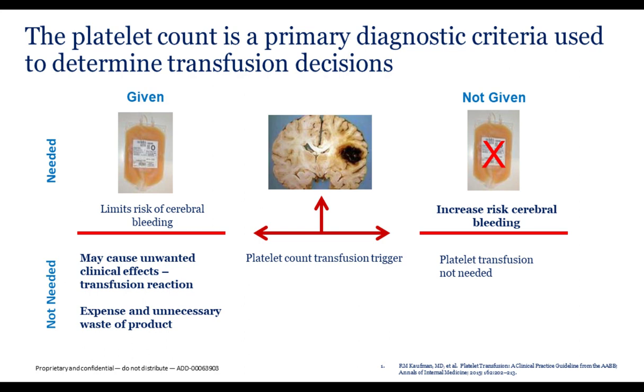Although sometimes the WBC fragments, even in the Neubauer chamber, are very hard to distinguish from platelets. But you can count giant platelets. You can see those clearly. But it does have a very low level of accuracy, as we previously described, and is imprecise at less than 10,000. So when it comes to suitability for transfusion decision management, I would consider it highly unreliable.